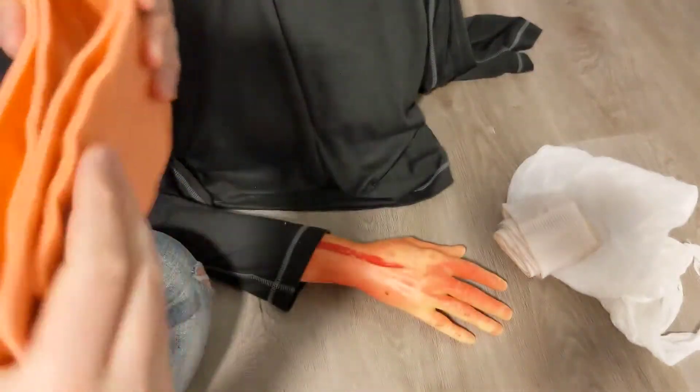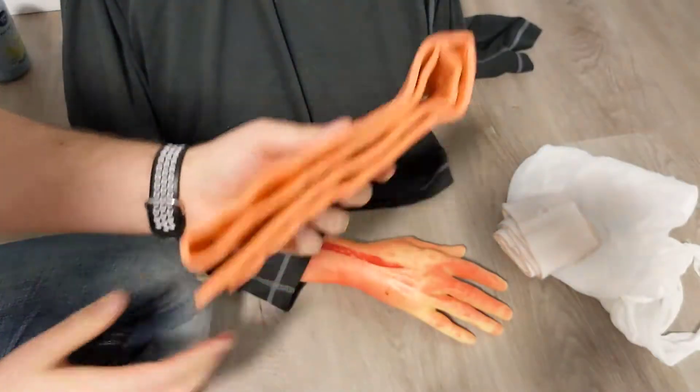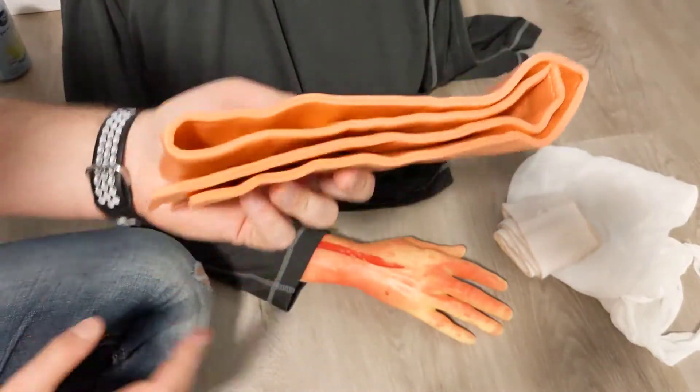SAM splints are fairly compact and fold flat, so they're not a huge size. You can do so many different things with them, making them a worthwhile piece of kit to carry for splinting.